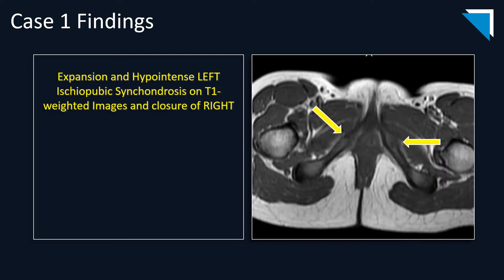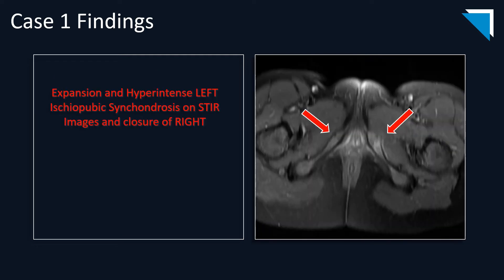On MRI, on this T1-weighted sequence, you can see asymmetrical closure of the right ischiopubic synchondrosis and expansion with hypointense signal in the left ischiopubic synchondrosis. On this STIR image, you can see edema and hyperintense signal surrounding the left ischiopubic synchondrosis and closure of the right ischiopubic synchondrosis.